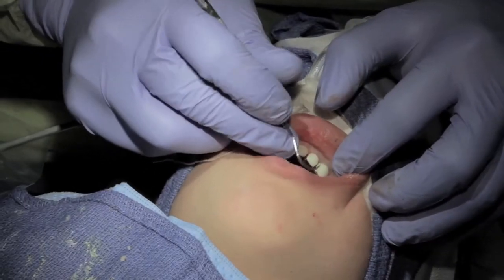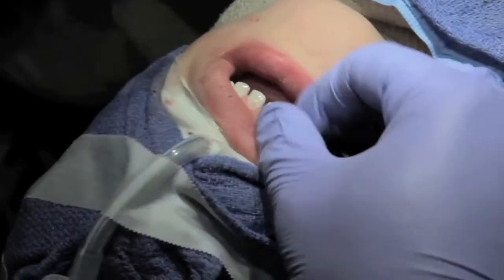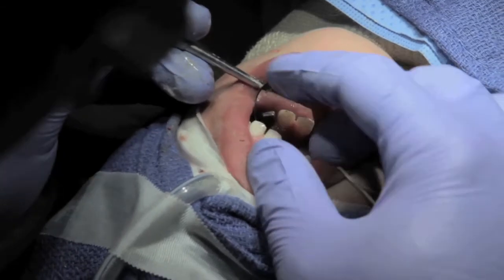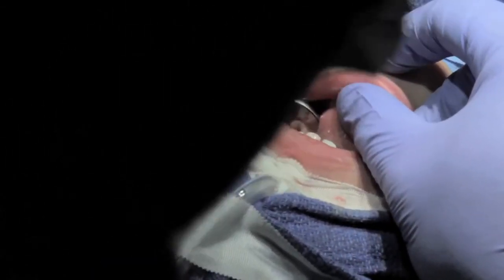Let's go around and remove any excess cement. As you can see, it fits perfectly. The gingiva, as long as the patient keeps it clean, will heal extremely nicely within a day or two. And that's it.